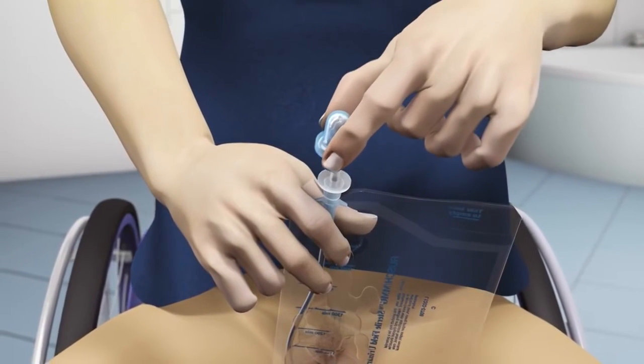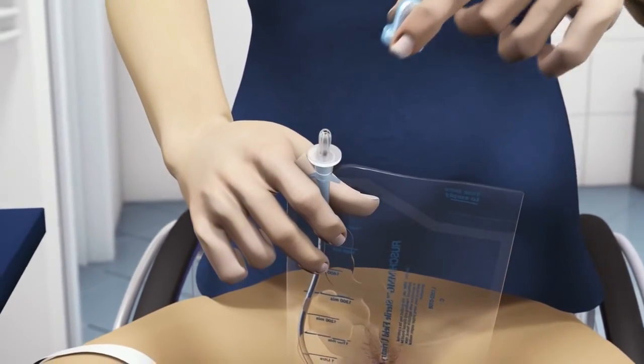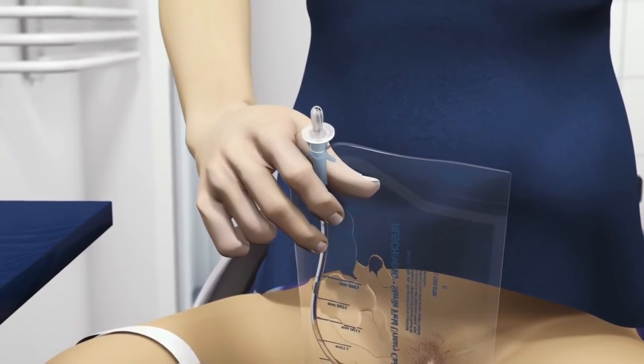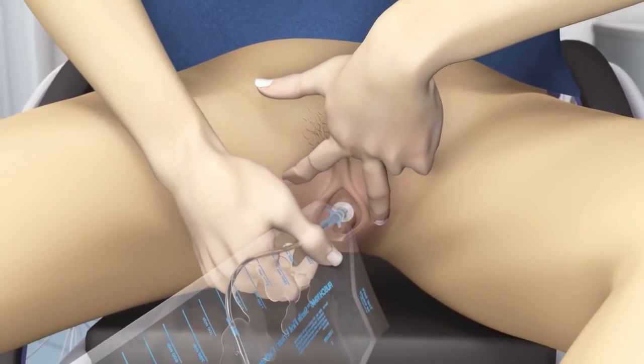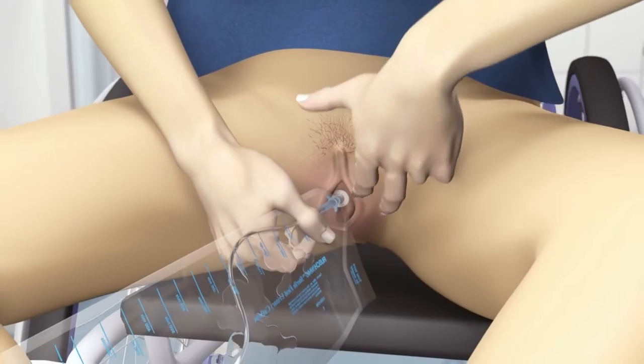If needed, add some extra gel to the introducer tip. The gel can be found inside the protective cap. If right-handed, separate the labia with your left hand using your index and middle fingers. Insert the soft silicone tip into the urethral opening using your right hand to guide the tip in.